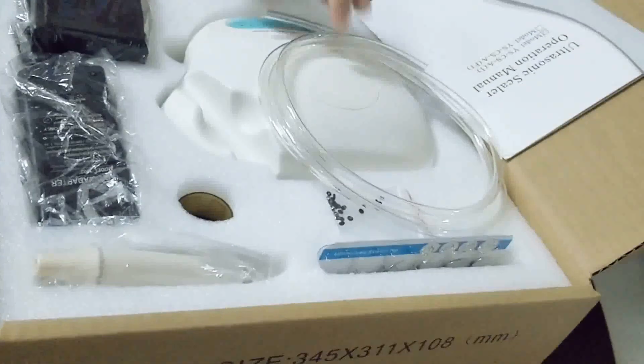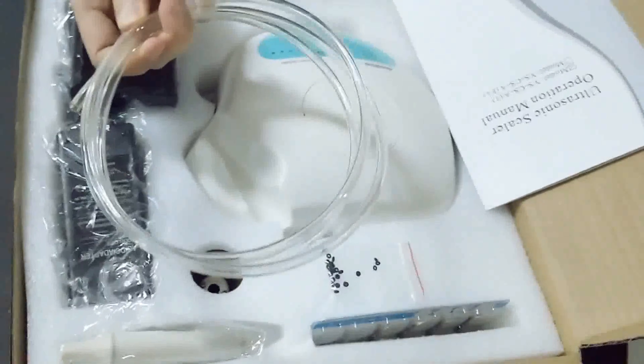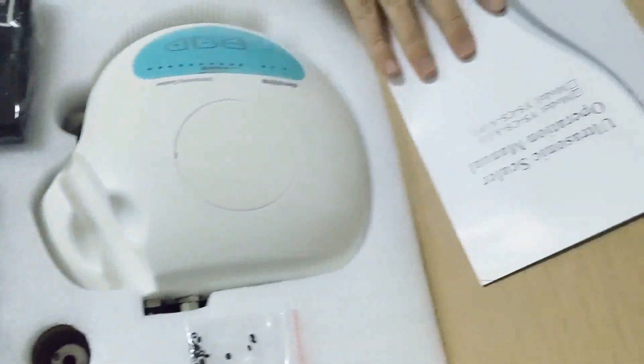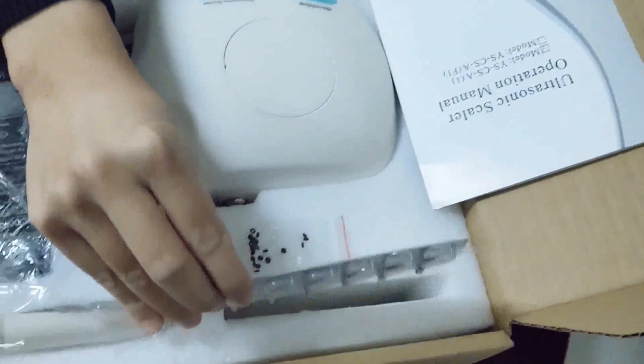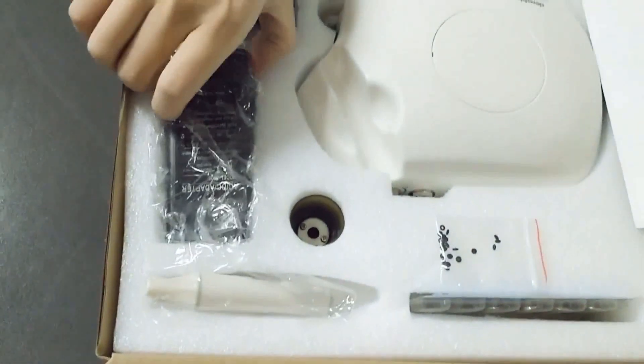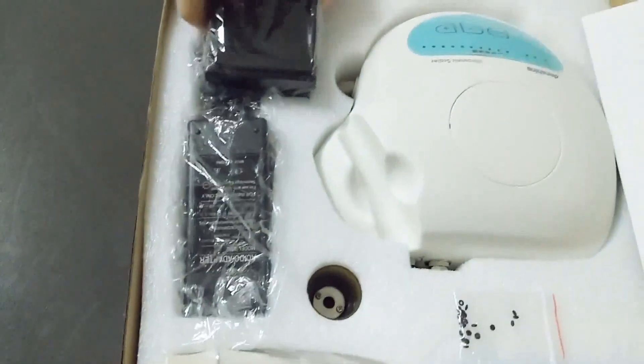The package includes water pipe, the main unit, manual, working tips, handpiece, transfer, and foot switch.